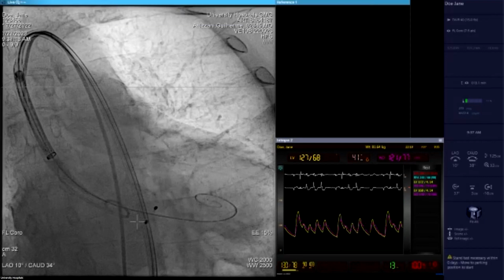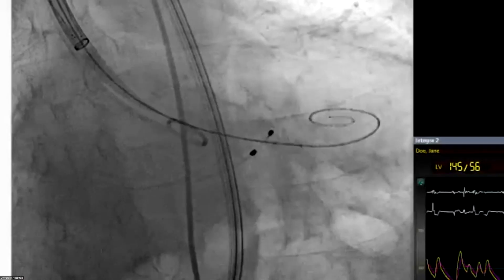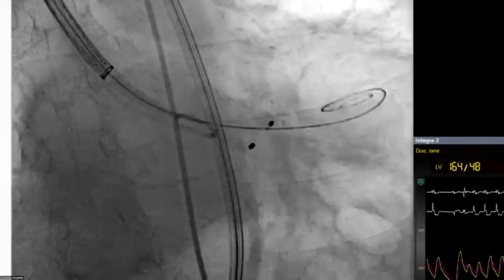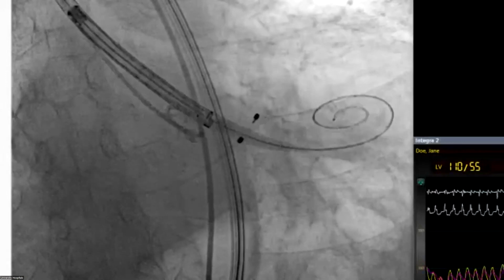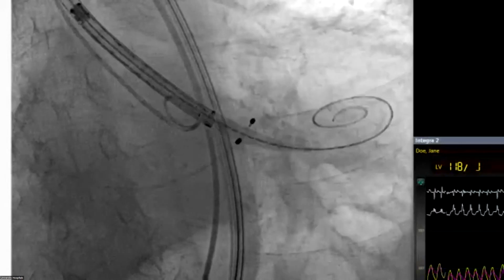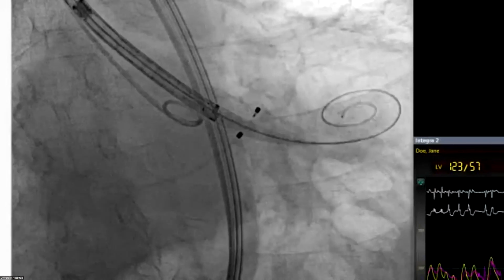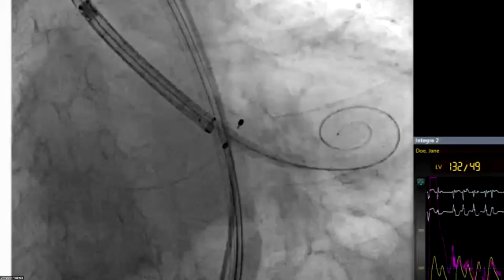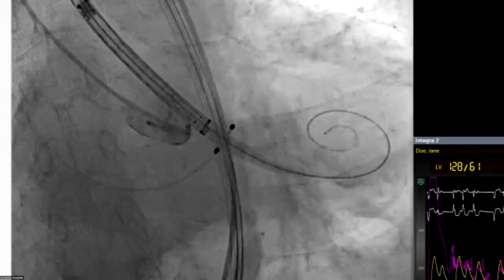That's our cusp overlap, near cusp overlap view. One second. All right, I have the R. Okay, I'm going in. All right, stop there. Okay. Puff. Puff, Hitesh. All right. Don't make it look so simple, Guy. No, we're trying to make it look very simple because it is actually. Puff. All right, you see the pigtail is playing a little bit with us. You're gonna try to reposition that there. Puff. There you go. Perfect.